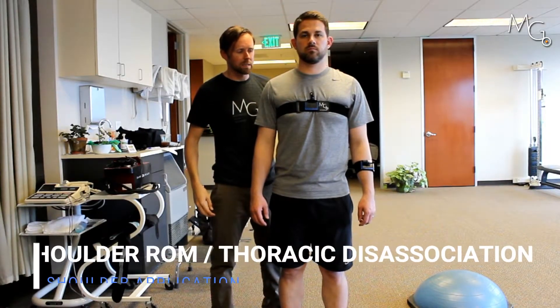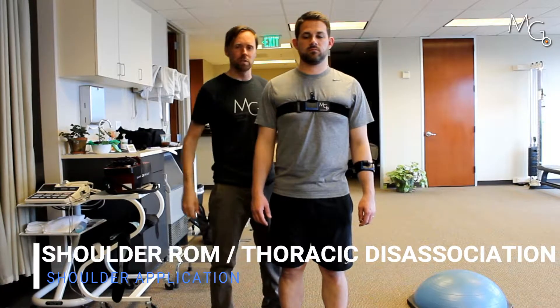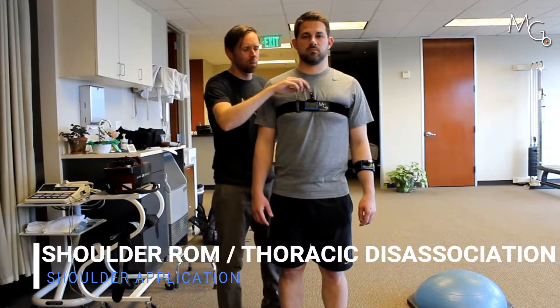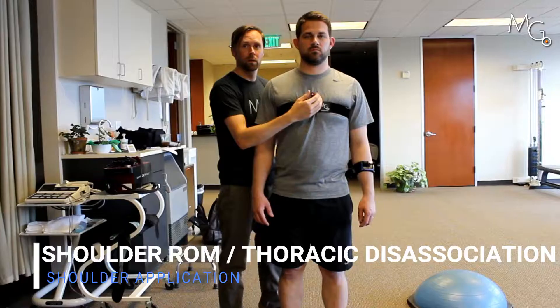Another way we can look at shoulder range of motion without thoracic compensation is by adding two lasers — one around the thorax and one around the shoulder. What we're going to do is turn the one on the thorax on and center it up on the target.